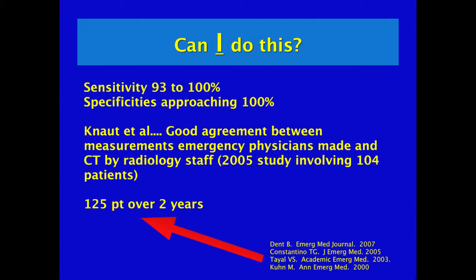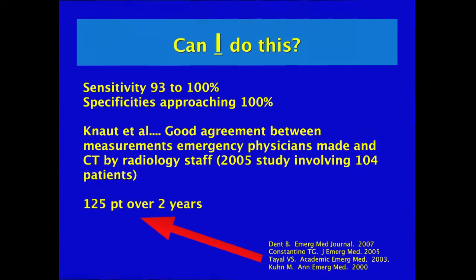You might ask yourself, can I do this? Well, there have been many articles showing that there is good agreement between measurements made by emergency physicians and by CT by radiology staff. These studies are from 2000-2007, but there are more recent studies that confirm this.